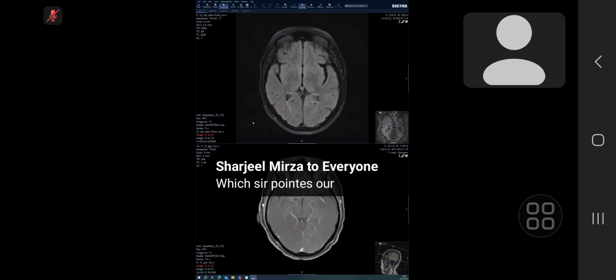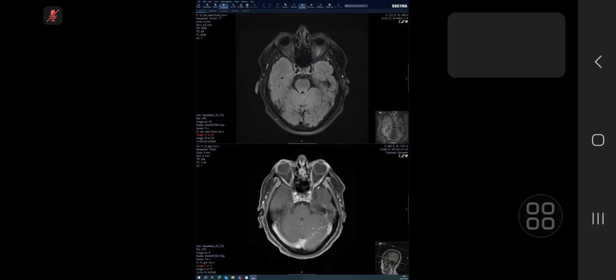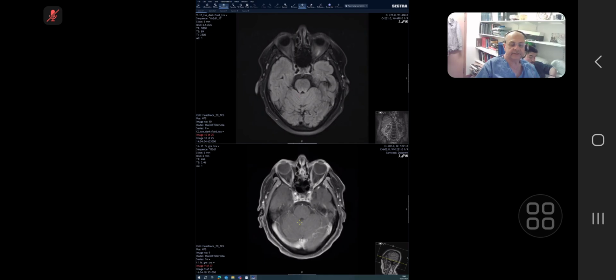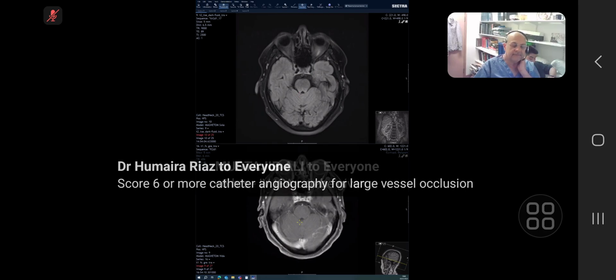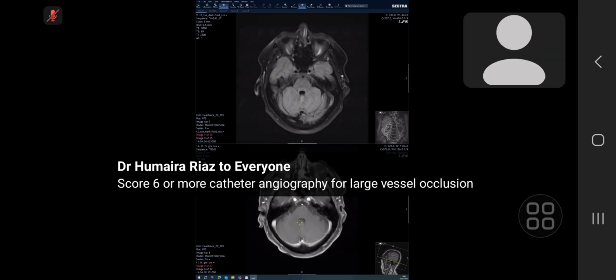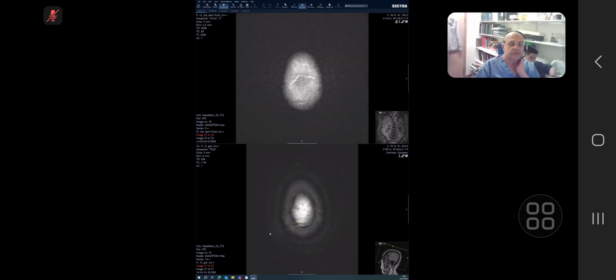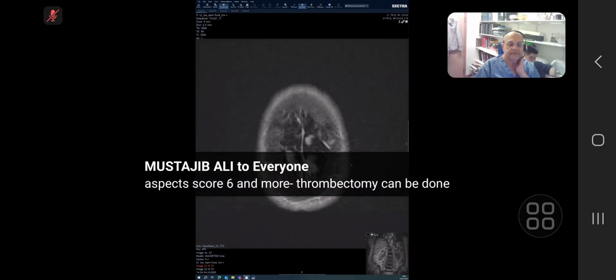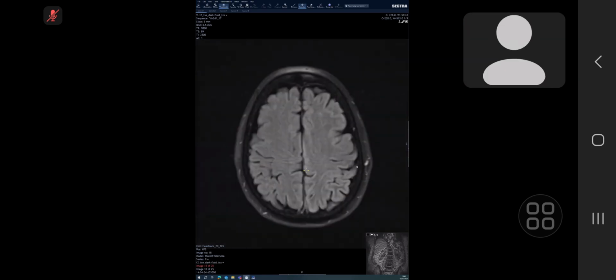Sir, the below image is the post-contrast, T1 post-contrast, fat-sat images. We always do fat-sat so that any fat does not mess up the post-contrast. So anything bright is either a vessel or enhancement. Please start from the vertex slowly. Okay, let's go through this first layer first.